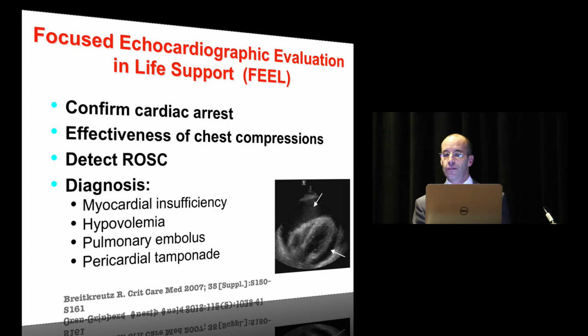There's another application that blends in well with the lectures yesterday about maternal resuscitation. It's the so-called FEEL protocol, or Focused Echocardiographic Evaluation in Life Support. If you change life support to resuscitation, like some people do, it's called the FEAR protocol, which is not very reassuring. But it has had a lot of utility. Basically, you have a cardiac arrest, and there is someone who's dedicated to the TTE. They will run in and have nothing to do with the management. It'll be dedicated to that function and that function alone. They will go subxiphoid placement of the probe and video it while they're doing it.